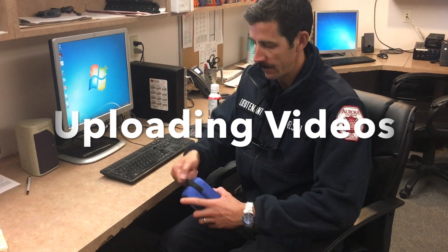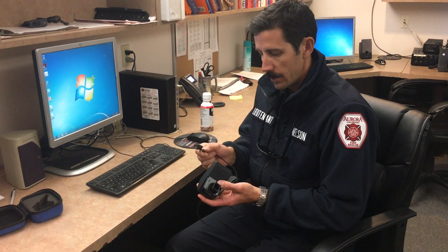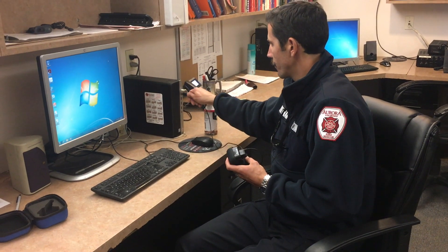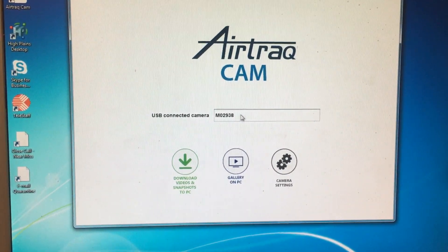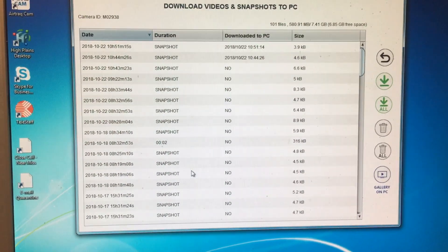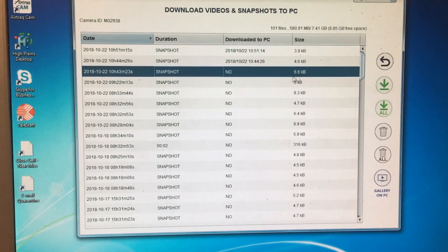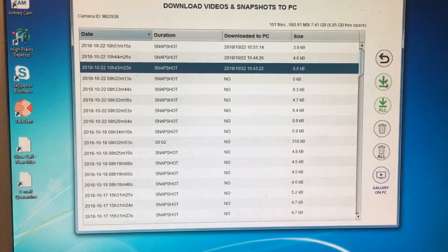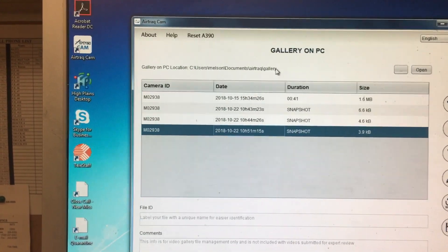Once your intubation is complete, take your video camera to your computer. Each station has a specific computer with the AirTrack software loaded on it. Plug the camera in via USB, then open up the AirTrack software. Once plugged in, you'll see it appear under the USB connected camera field. Select 'Download videos and snapshots to PC' — this will pull up every video and snapshot taken from the camera. Select the intubation you want to upload, go to the green button, and hit upload. You'll then see it uploaded to your selected folder and ready for viewing.